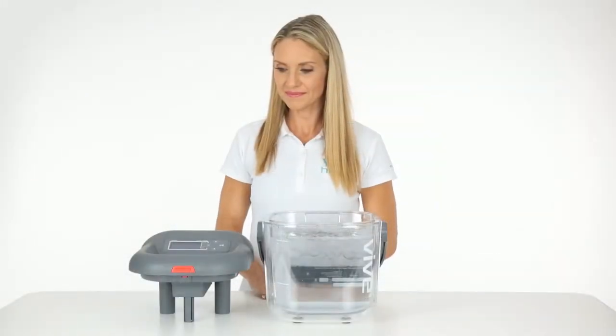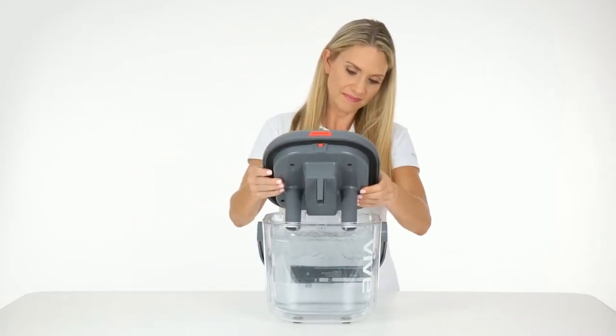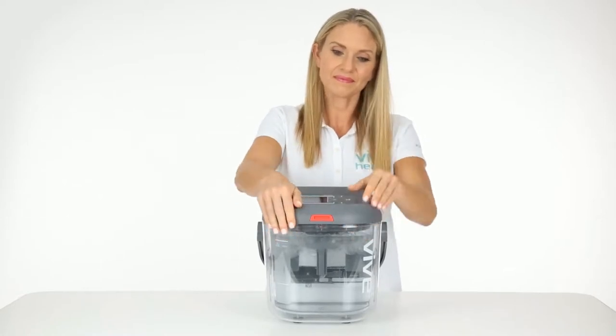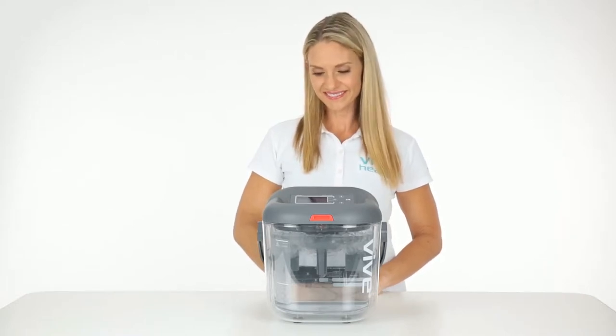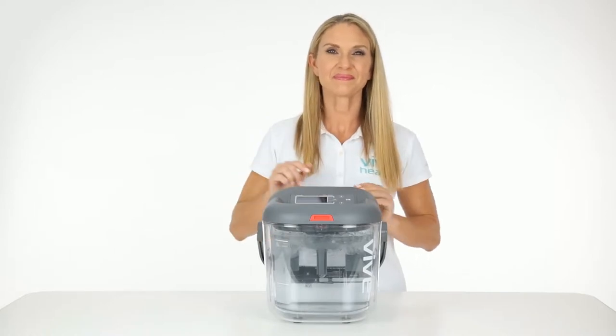To attach the lid, tilt the lid into the grooves of the bucket. Make sure that the clasp is securely latched at the front of the bucket. If the tubes on the lid don't reach down into the water, add more ice or water, but do not exceed the max fill line.